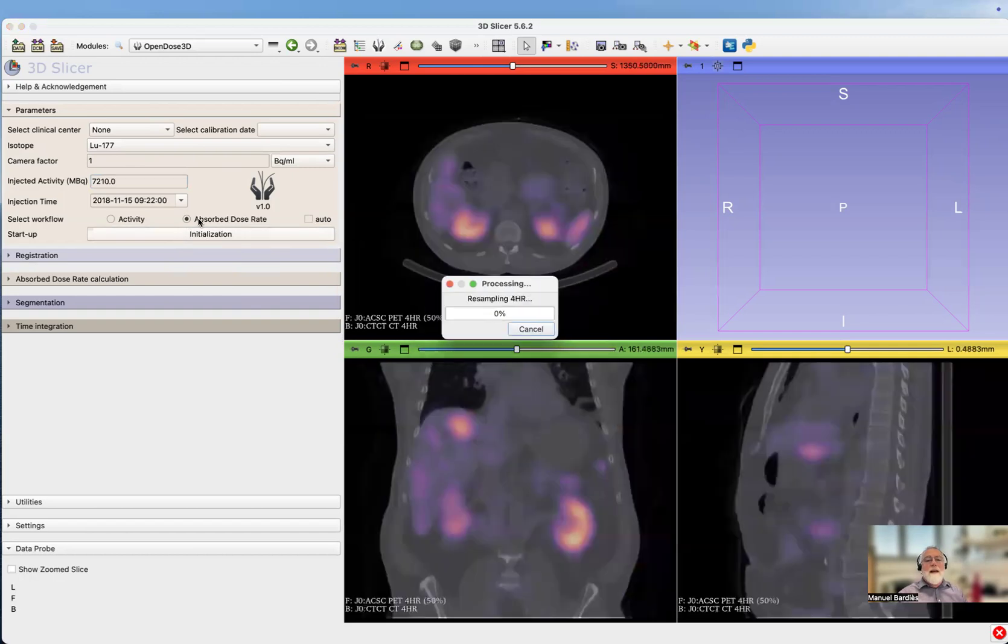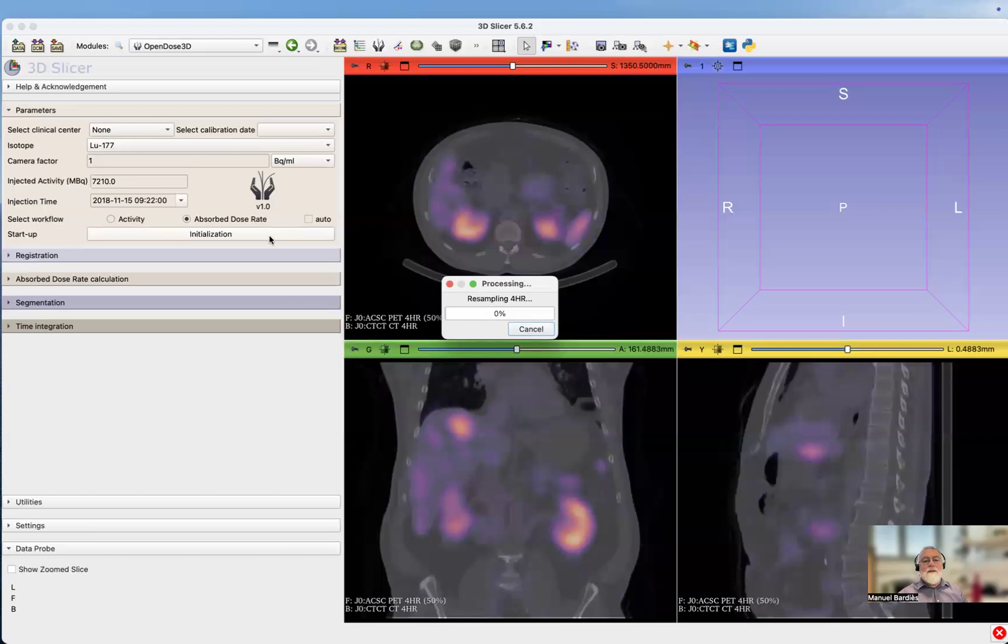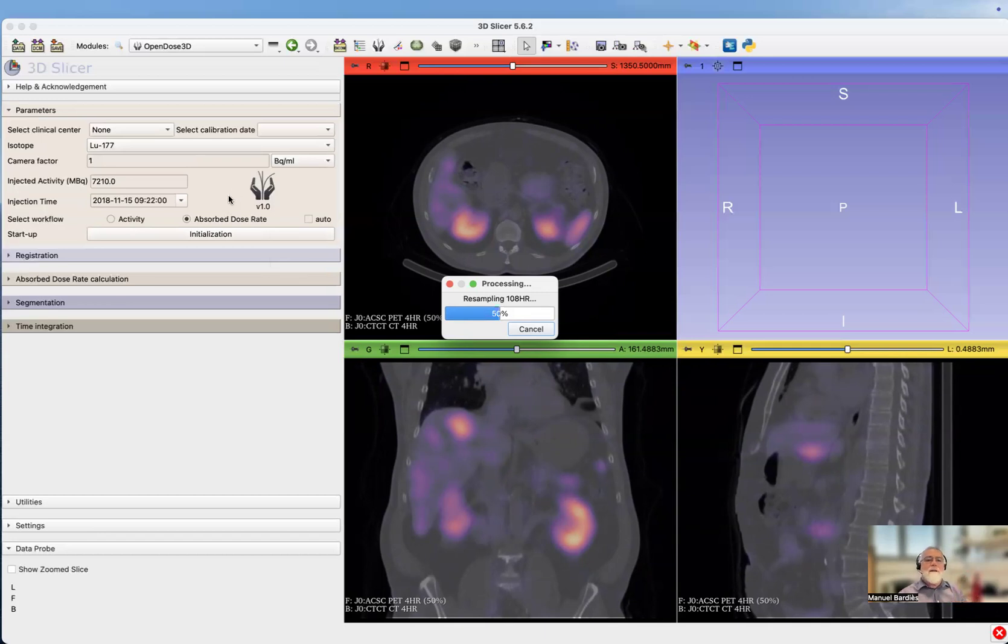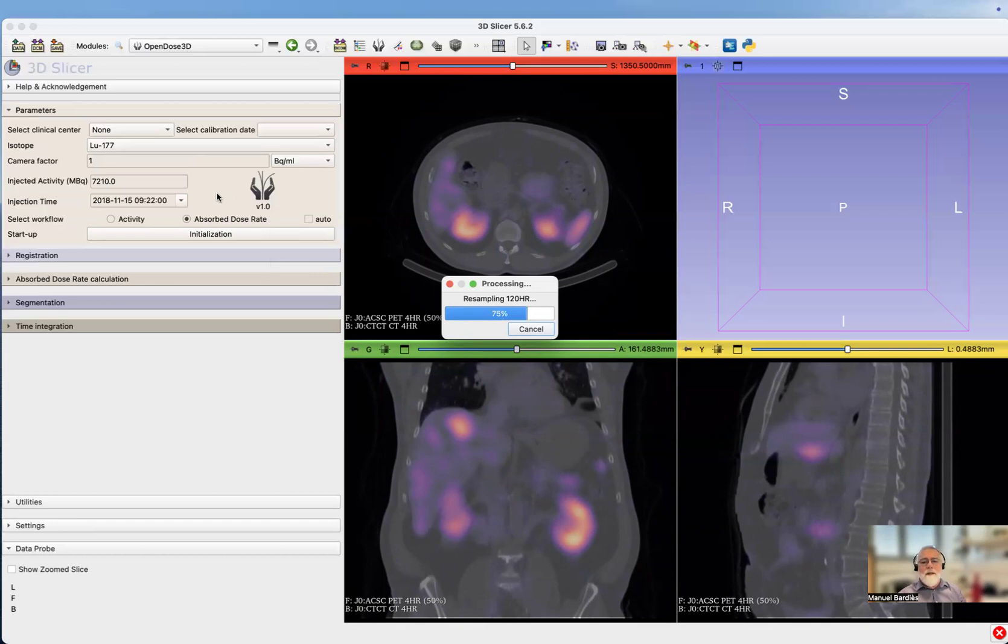I've been selecting by default the absorbed dose rate workflow. What the software does is first resampling all the images, resampling the CT images at the spatial sampling of the SPECT images. Then it's creating new files, putting that in very specific folders. We'll see in another video the different folders and files that are being created at every step of OpenDose 3D.